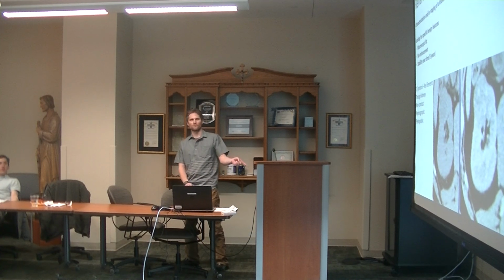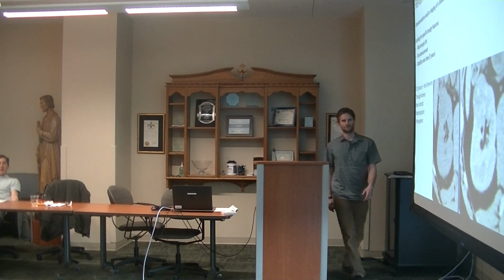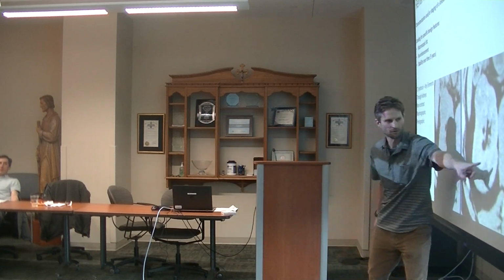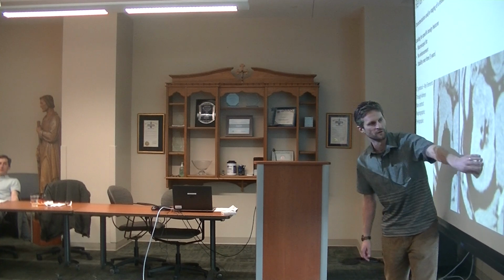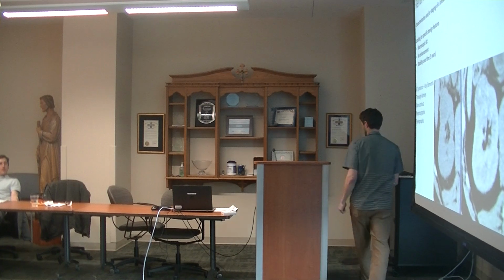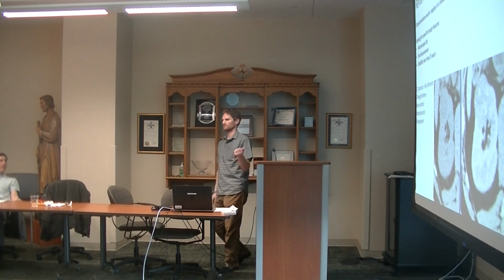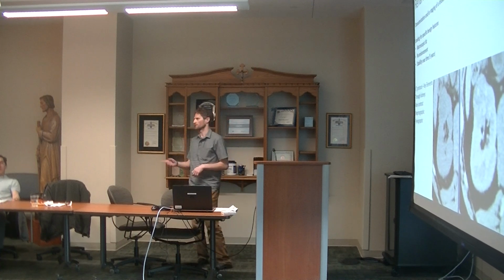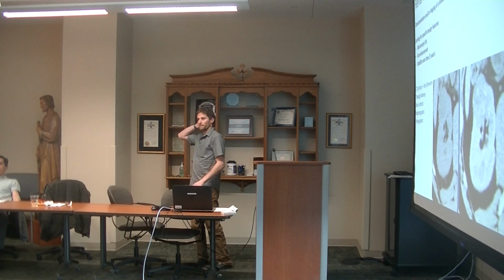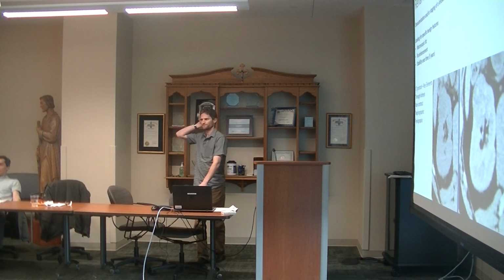Some old protocols had the corticomedullary phase, which is a little bit earlier. You could see the differentiation between the renal cortex, which goes around, and the renal medulla, which is histologically different tissue, so it enhances differently at that point. It's not critical for detecting just regular enhancement. The nephrographic would be about 100 seconds. Yeah, that's definitely not on the new one.